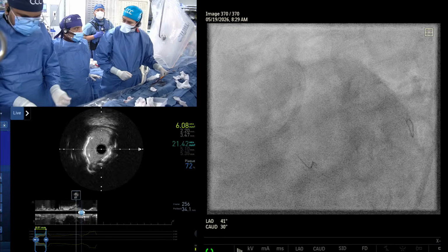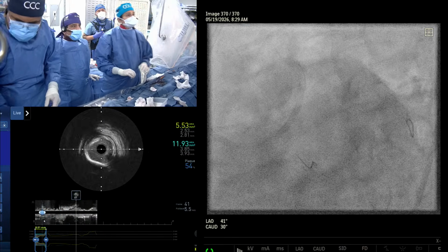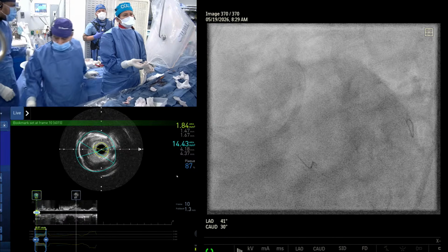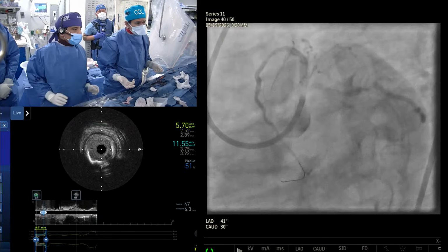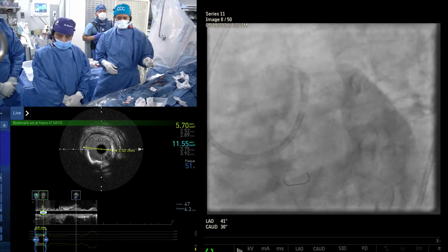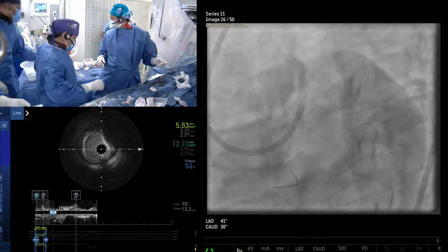A 3.0 cutting balloon? Cut where? The circ. The same one the IVL will do for the left main. Let's put a stent in the circ first, or do you want IVL first? I have a regular balloon. Why do you want a cutting balloon? That's okay also, because why put an additional cost into a little bit of calcium. But proximally, nothing there more. So you have the imaging there. It really is amazing, there's so much calcification in the ostium and proximal LAD and none in the circumflex. Yep, that's correct.